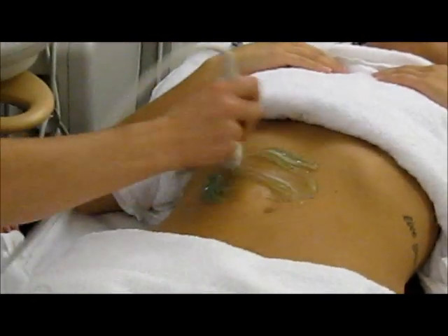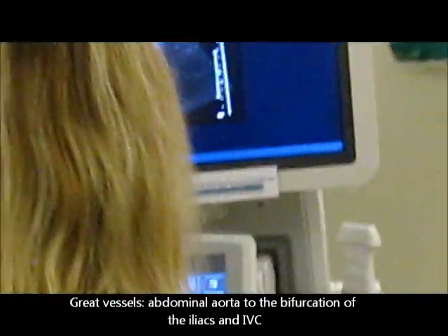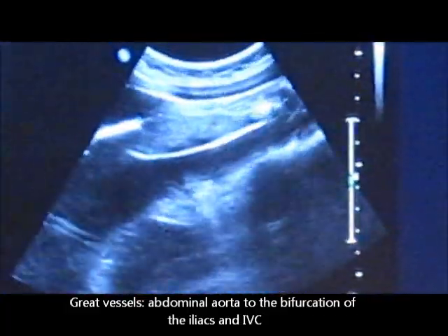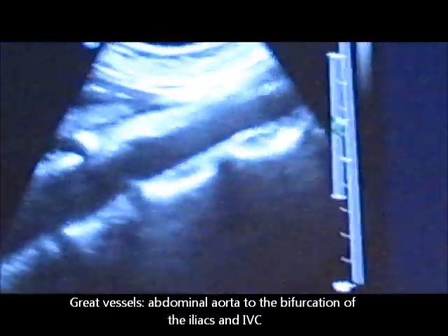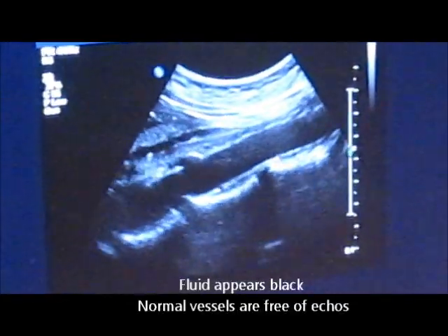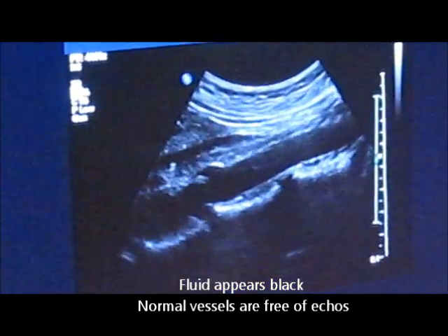So the first thing that we normally look for in an abdomen ultrasound are the great vessels. So you have your aorta and your IVC. Just going to scan around for a minute to get my orientation. So the aorta is the largest artery. It goes down the middle of the belly from the heart, and it has a pulse. You can see it moving on its own. It's right here. All fluid appears black on ultrasound. Since the vessels are full of blood, they're going to appear very black.